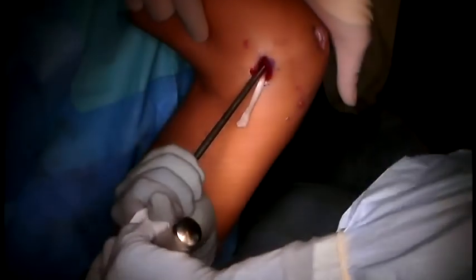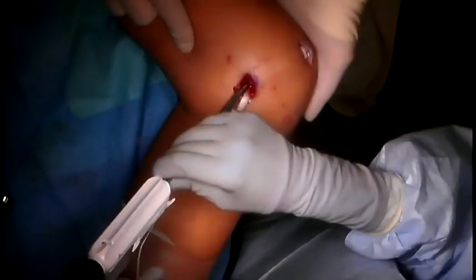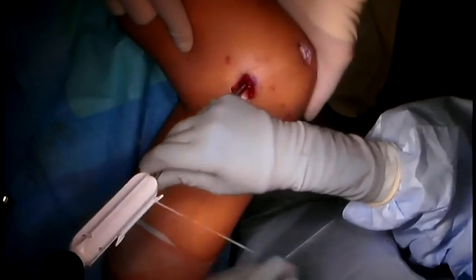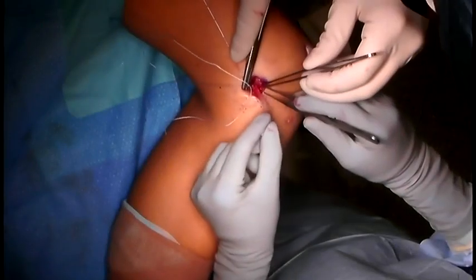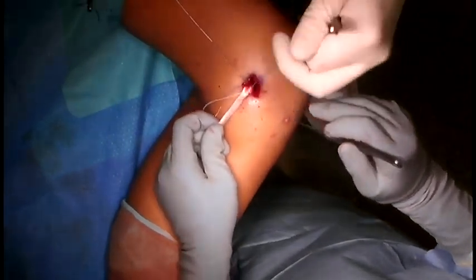Once these are confirmed, the anchor is deployed within the tunnel for definitive fixation of the graft. The remainder of the graft is amputated and standard closure is then performed.